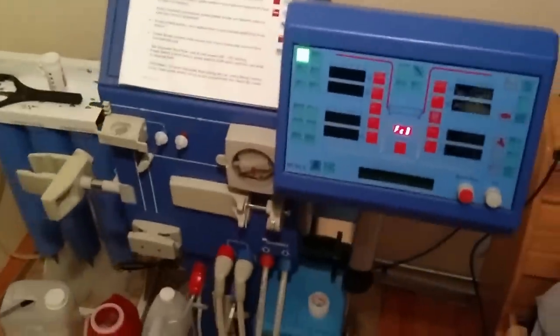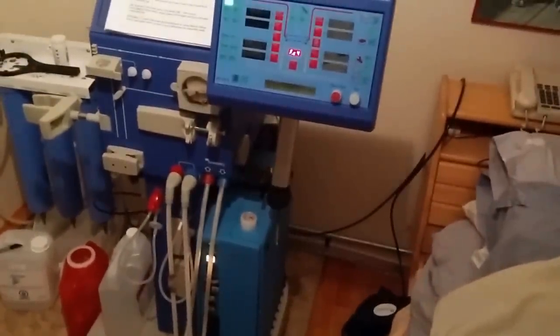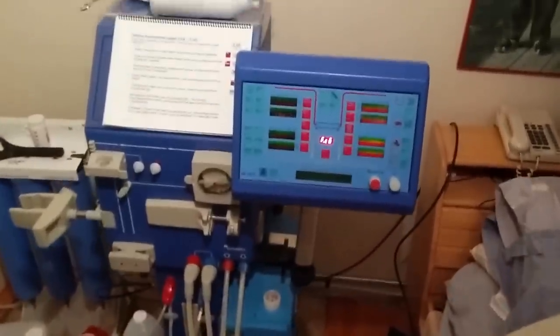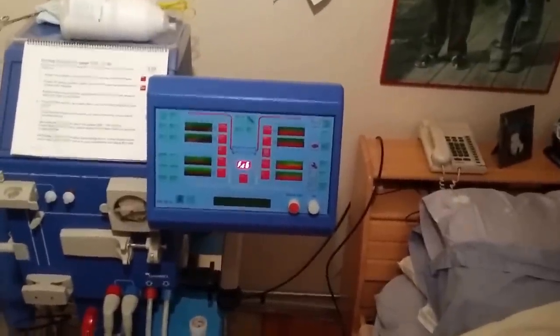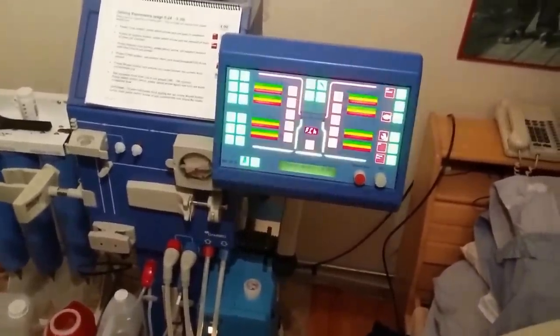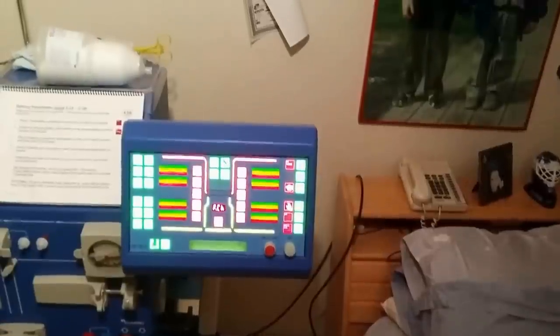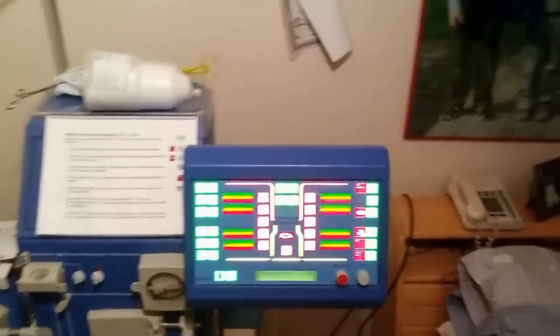This is a GAMBRO AK95S home hemodialysis machine that I'm setting up for my grandfather. He does nocturnal hemodialysis at home four nights a week. I set up the machine and run the treatment for him, and tonight I took a video of how I set it up. Hopefully it's useful to anyone that has this machine or a similar machine, or is considering home hemodialysis.